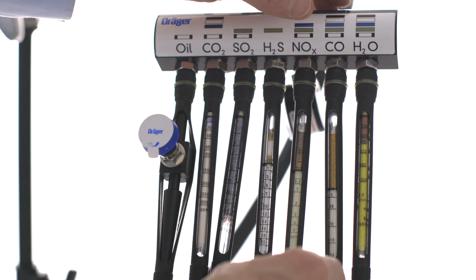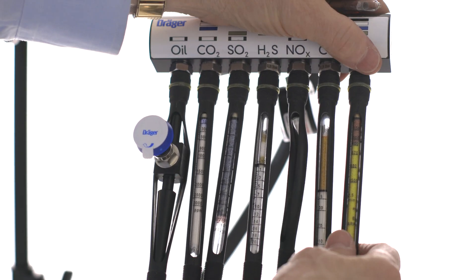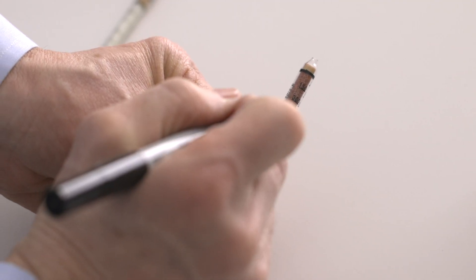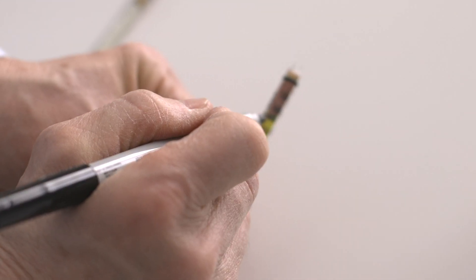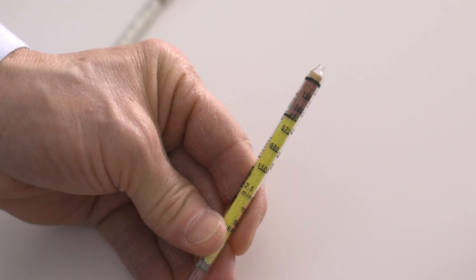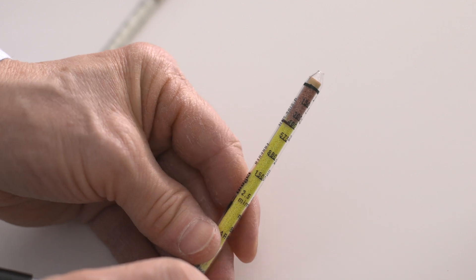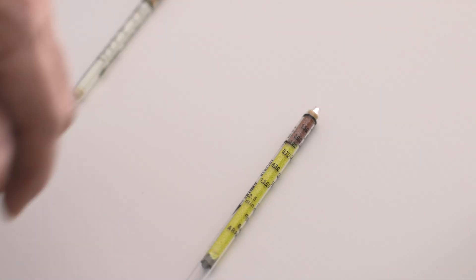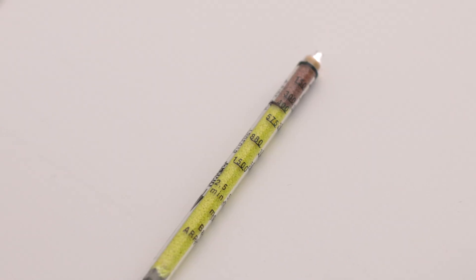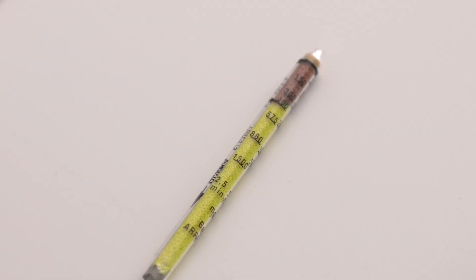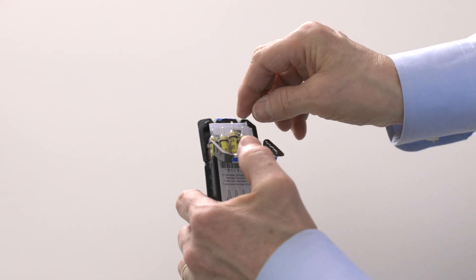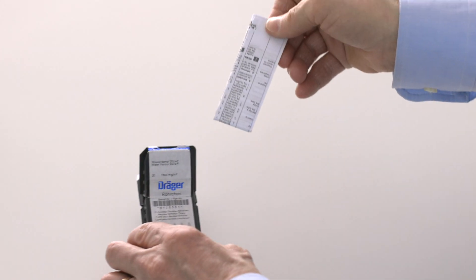At 2.5 minutes, remove the nitrous fumes and water vapor tubes. Evaluate the reddish-brown discoloration on the water vapor tube immediately. Using an indelible marker, mark the endpoint of the reddish-brown discoloration. Always read the total length of the slightest discoloration on a detector tube. In this case, the discoloration is reading 400 milligrams of water per cubic meter. There are instructions for reading the results inside the package of each tube.